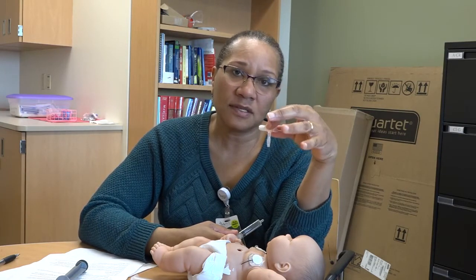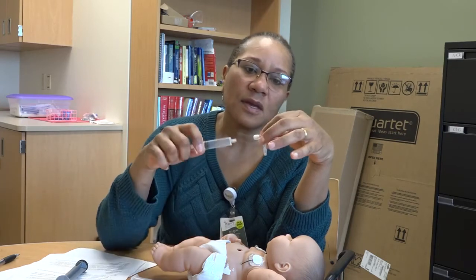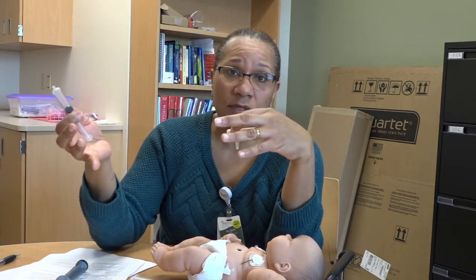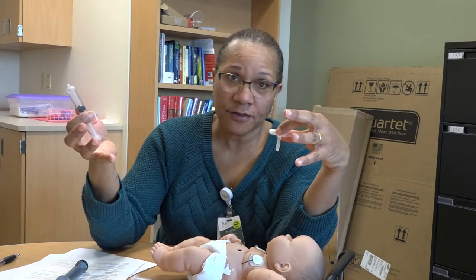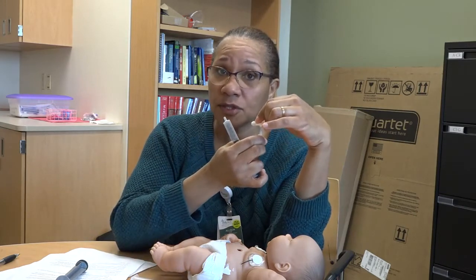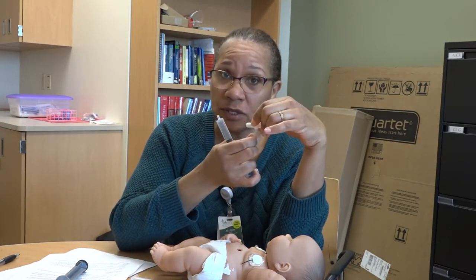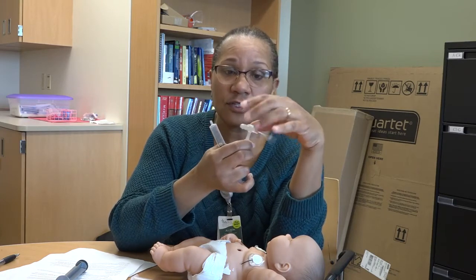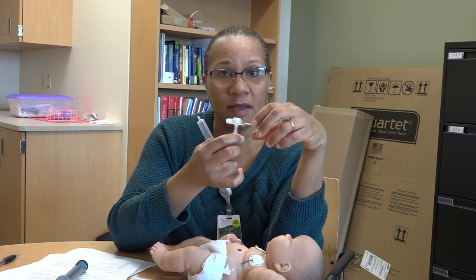It very well could be that some of the water just evaporated. If there is a lesser amount now, an hour and a half later, 2 hours later, then we know that there's something wrong with this balloon. It maybe has a slow leak, something is defective with that balloon. We're going to have to change the G-tube at that time.